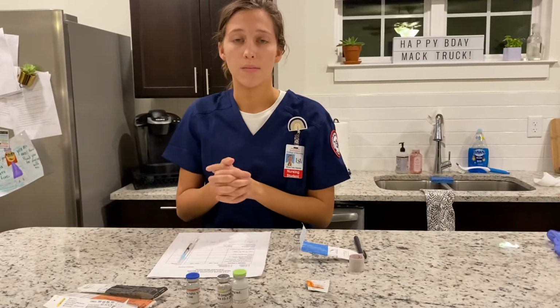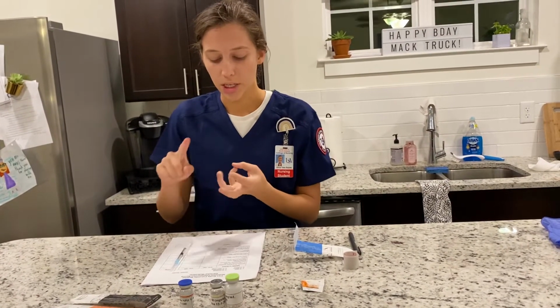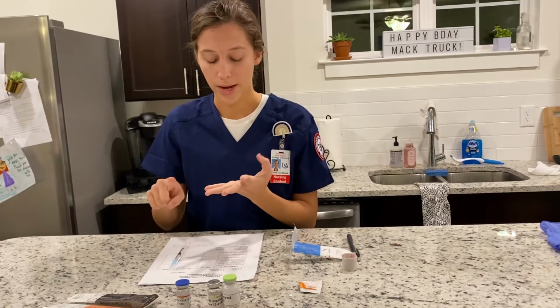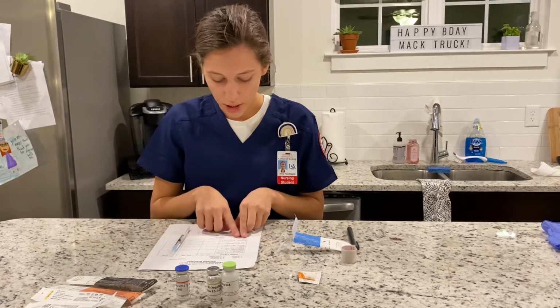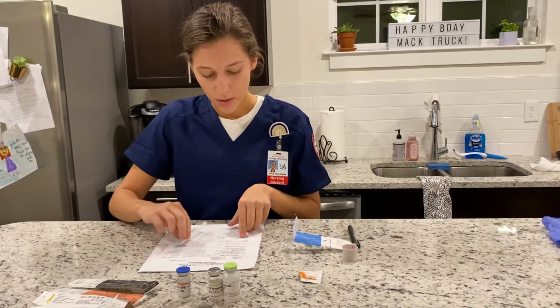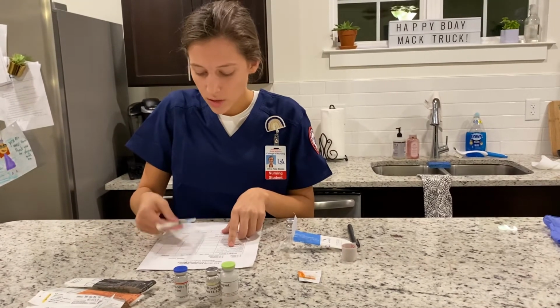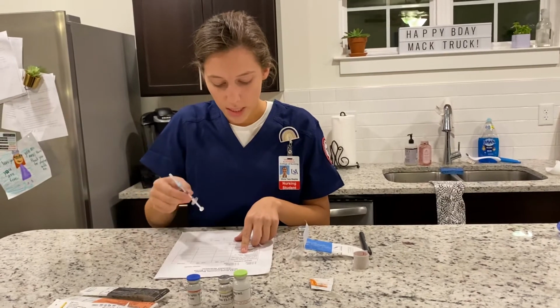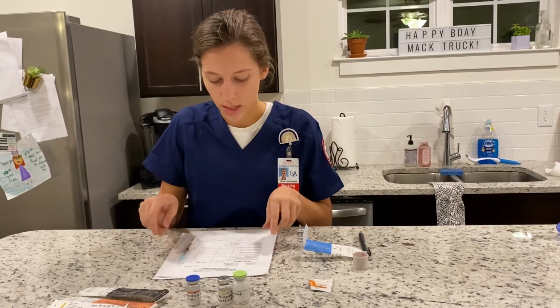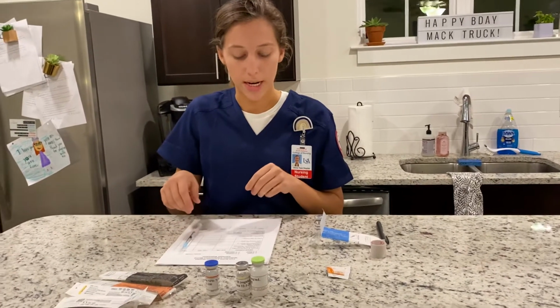So now I'm going to perform the second check of accuracy. I'm using the 5 rights. I'm going to check the patient's name, the correct drug, the correct amount, the correct route, and the correct time. So I notice the patient is Jaguar Jones, and he's going to be given heparin, 5,000 units or 0.5 milliliters subcutaneously, so we're going to be using the TB syringe every 12 hours, and he's not been administered medicine in 12 hours, that's why we are administering it now.